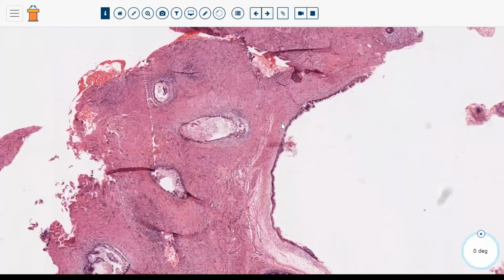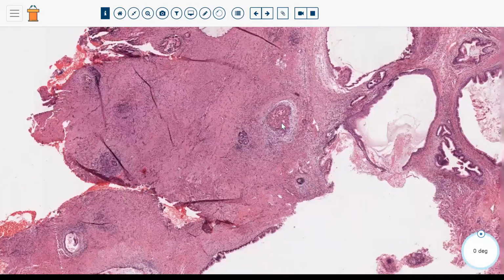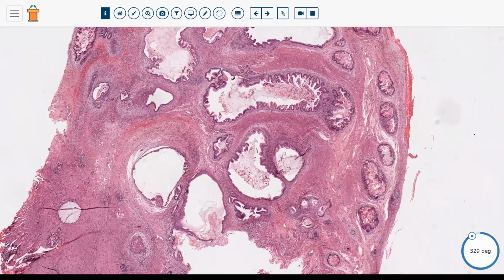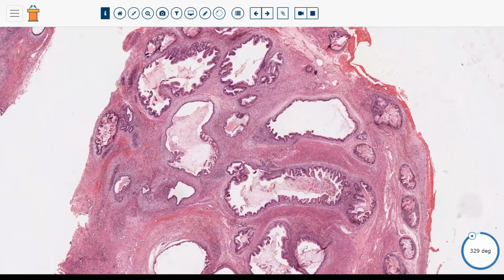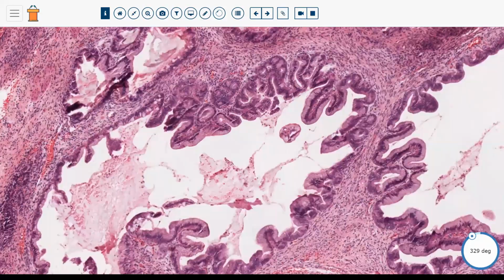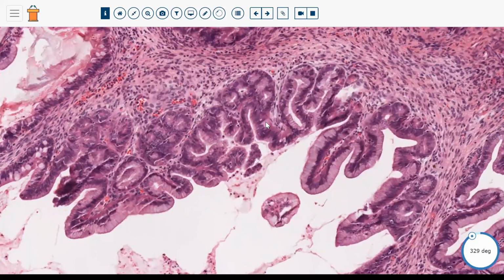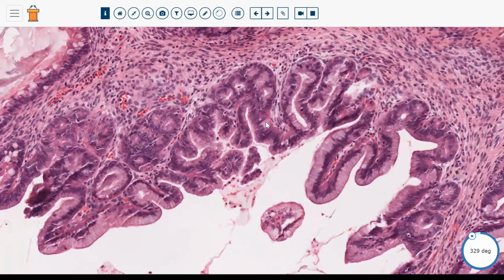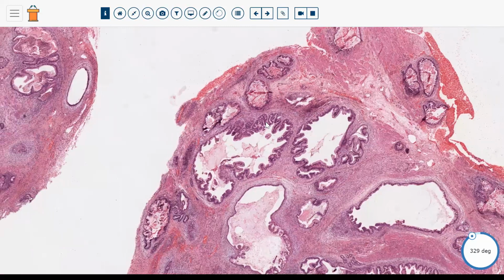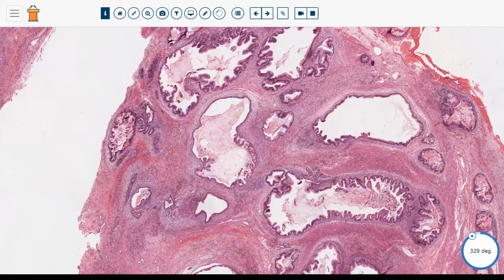If you have a postpubertal patient who has an apparently pure teratoma in the testis, and you don't see any other components, it's important to remember that the vast majority of those are malignant, despite being a quote-unquote pure teratoma. Some of the clues to recognize a postpubertal type of teratoma, aka a malignant one, is that the elements are often very haphazard.